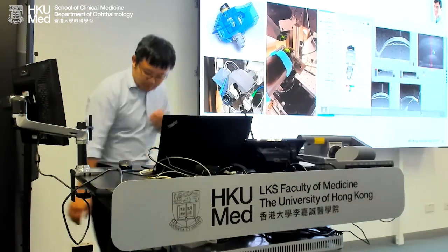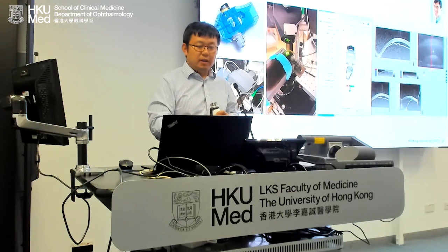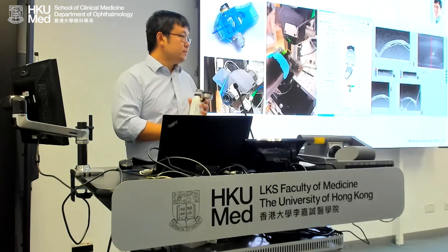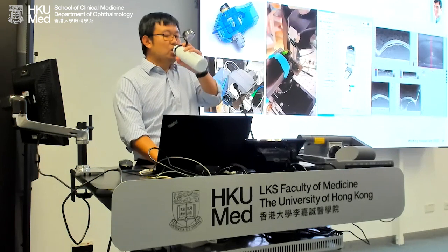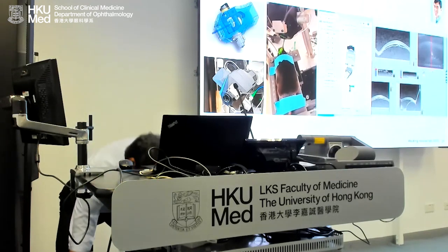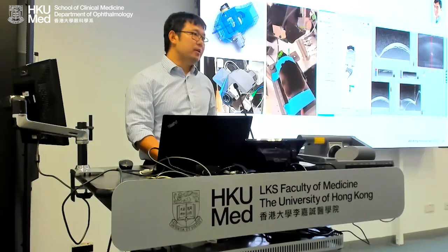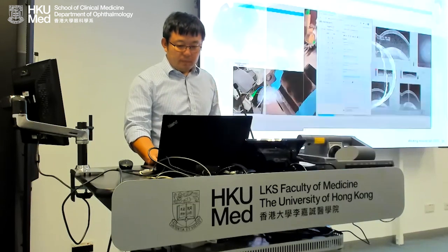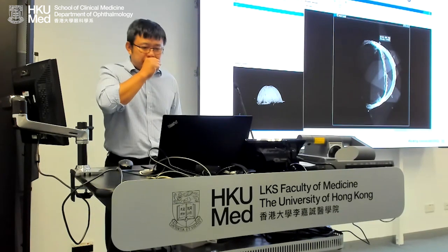And this is the pupil camera showing the pupil as the eye is being scanned. The OCT is about the size of 2 phones. Just mounted on a robotic arm, it has to be as light as possible for accuracy reasons. This project is led by Raymond. Raymond is an MD PhD student who will become an eye doctor someday. Let me just show the results from last week.